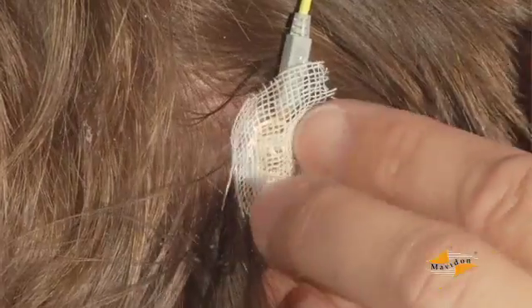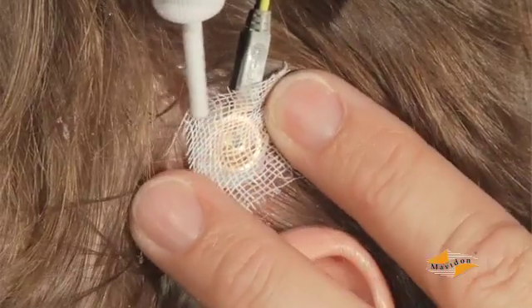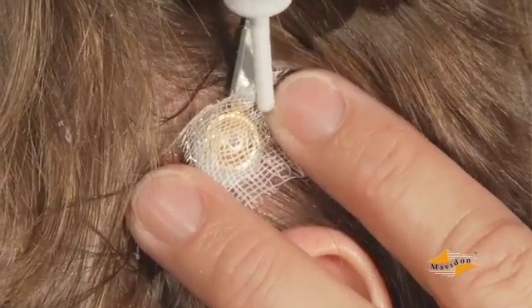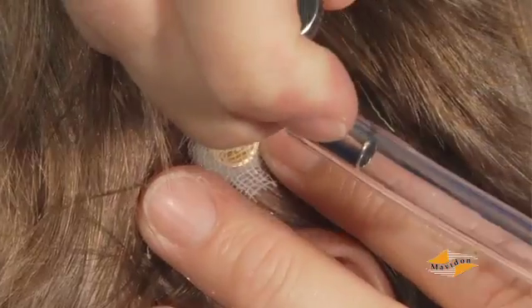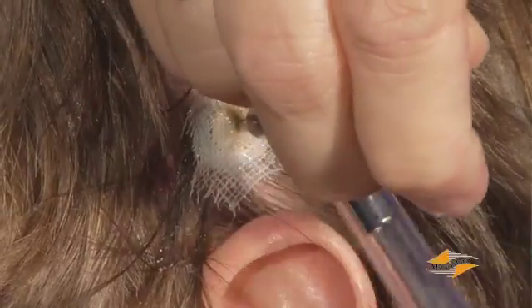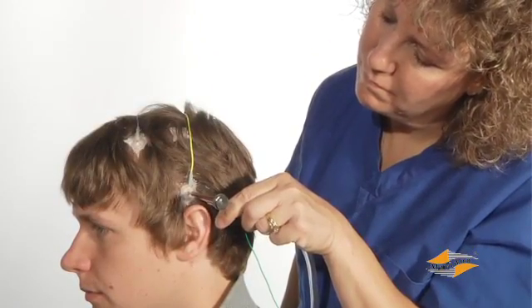Replace or reattach any loose or broken electrodes by first removing any excess dry collodion in the area, then use a new gauze pad and collodion. Always inspect the electrode sites for irritation, soreness, or other problems that might occur where the collodion adheres to the skin.